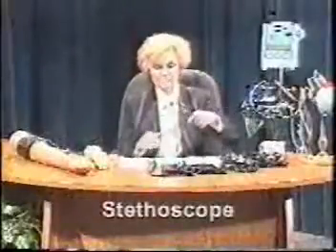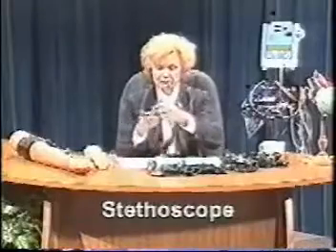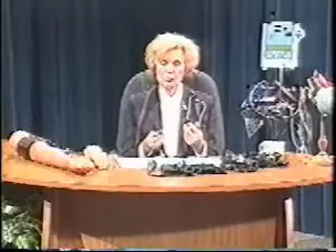There are a number of pieces of equipment that are necessary for blood pressure determination. The first is the stethoscope. This is a typical looking stethoscope. It's responsible for magnifying the sound that's heard when checking the blood pressure.